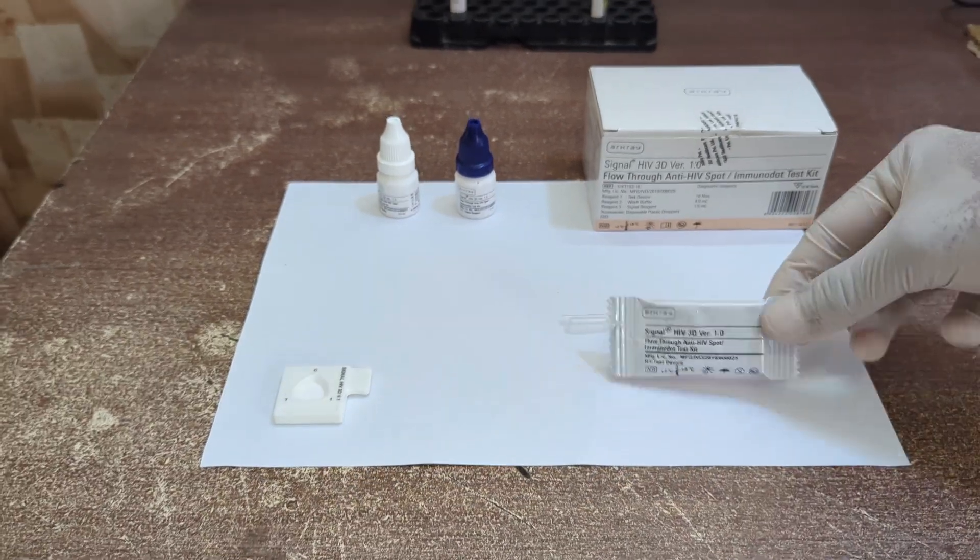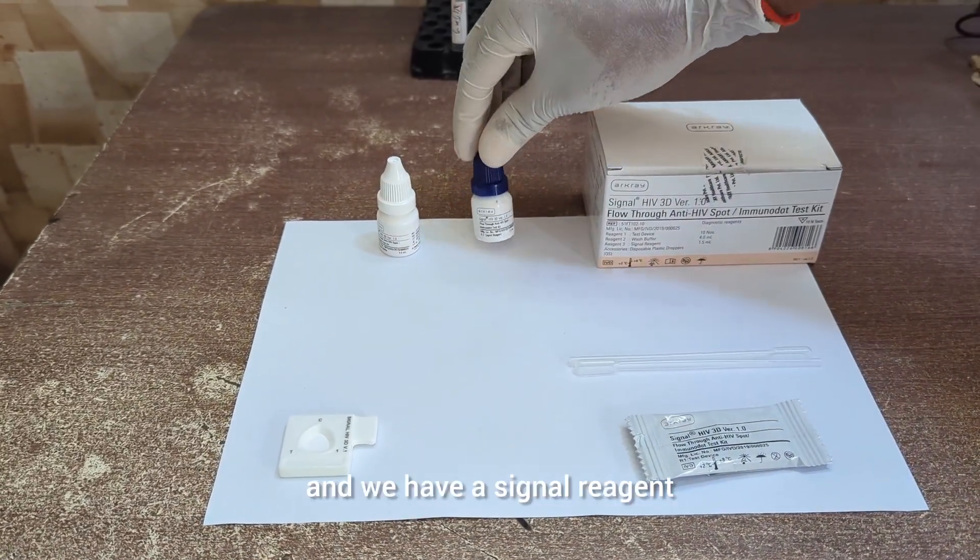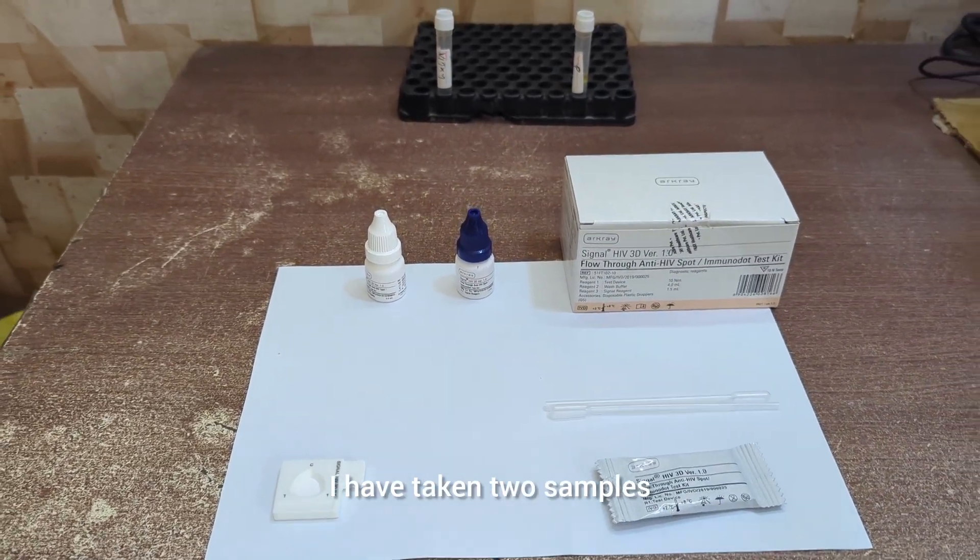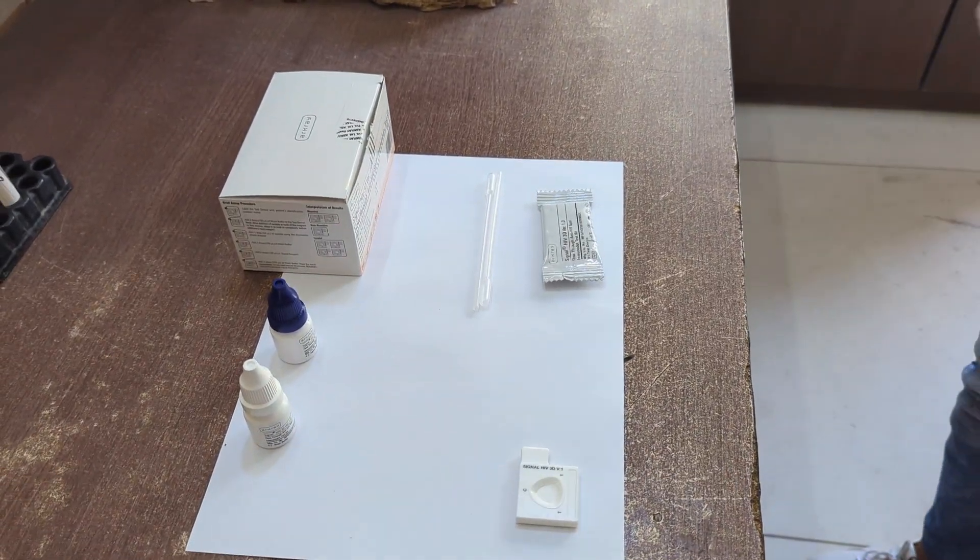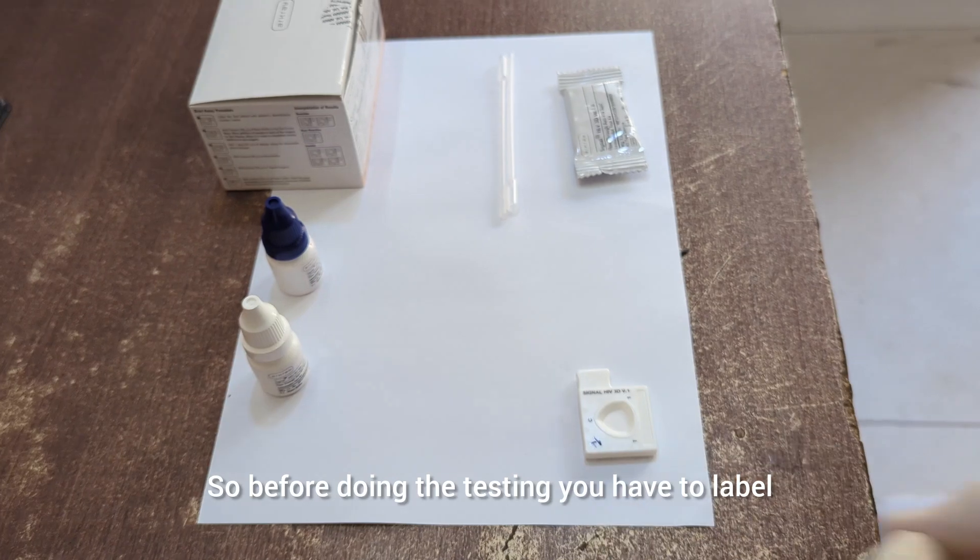In the box we have a test kit, a wash buffer, and a signal reagent. For better understanding, I have taken two samples: one is an HIV positive sample and another is an HIV negative sample. So I have taken two test kits.